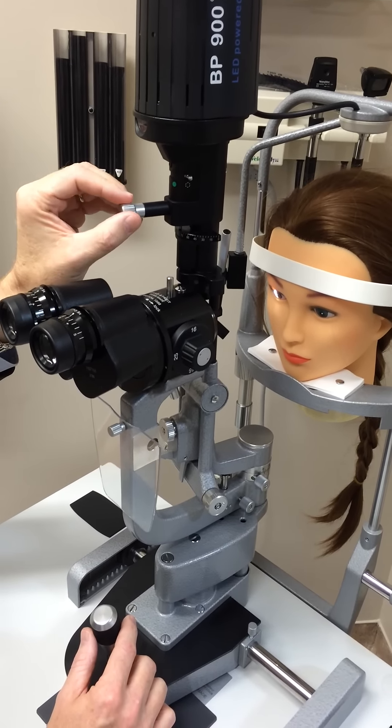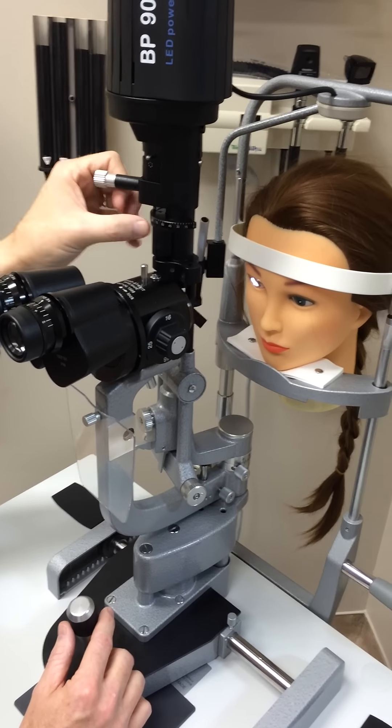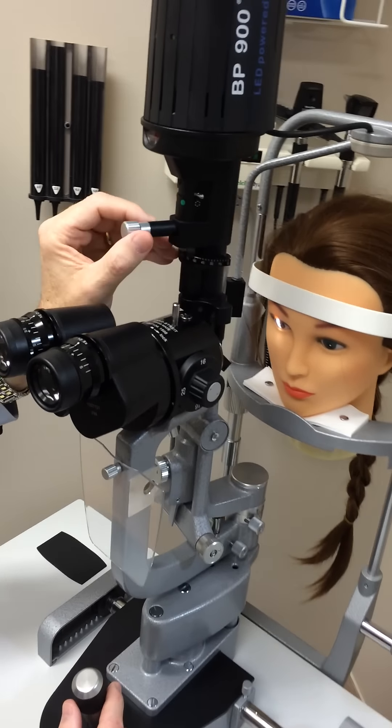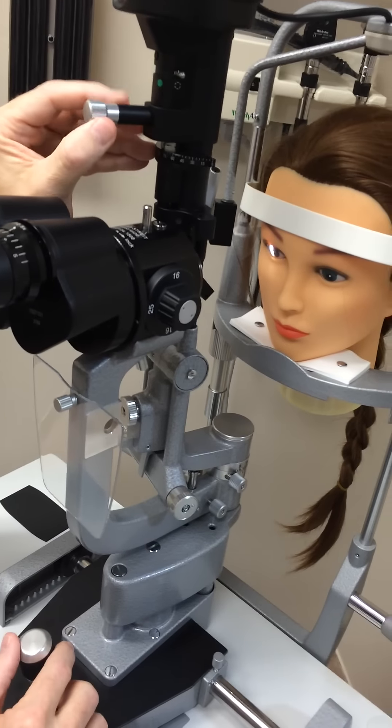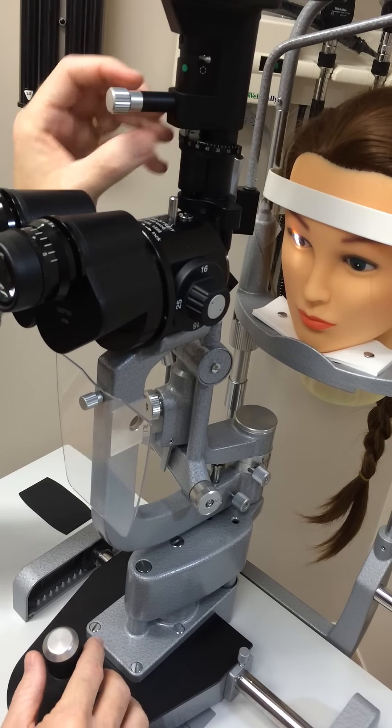If you notice you're having problems with the lamp, some people get this thing out of adjustment by turning this. If the lamp's turned sideways, you need to make sure this button is at 90 degrees — that will put the light straight up and down. You don't want it over here to the side, otherwise the slit will be at an angle. So you can fix that.